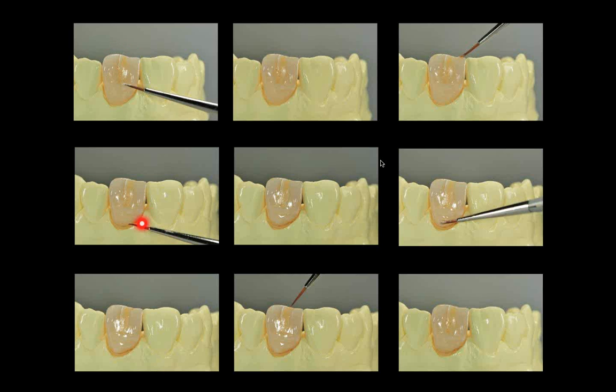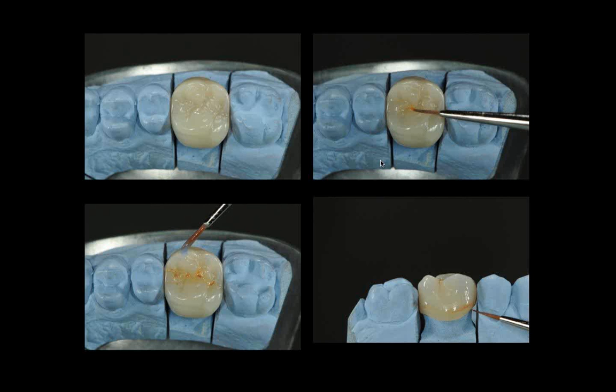If you want to make it go in, you have to put a dark color. So you always have to put a contrast color, white, dark, or light, dark, to make something look more enhanced. Here, the same Suprinity crown, which you see here, was basically also polished before and then afterwards crystallized and just a few stains added, if you want to do that.